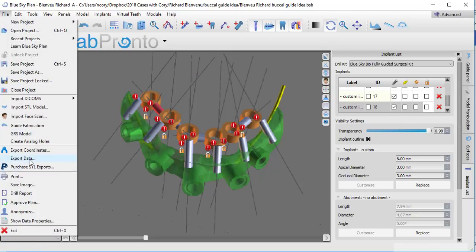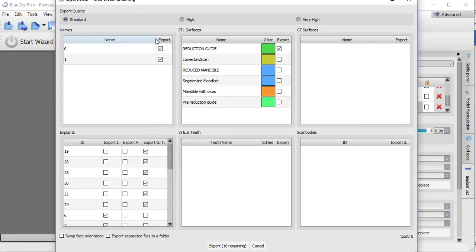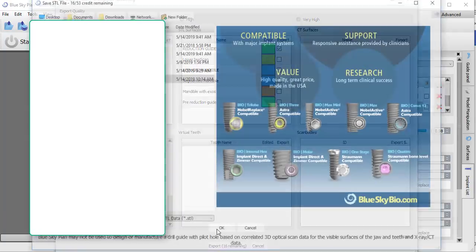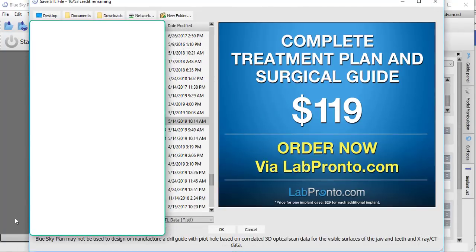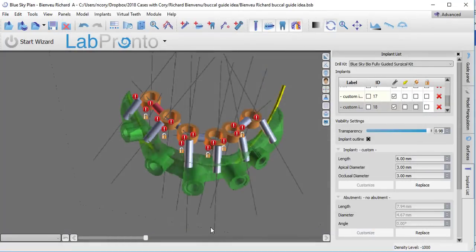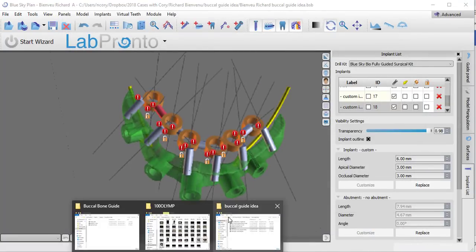So now I'm going to go up to export data. By default, anything that you've got visible on the screen should be checked on when you go to this step, so we shouldn't have to do much. The reduction guide's checked on. All of these individual guide tubes and implants are checked on. So I'm going to export this, and this one I'm going to call drilling guide. Okay, so let's open these up.